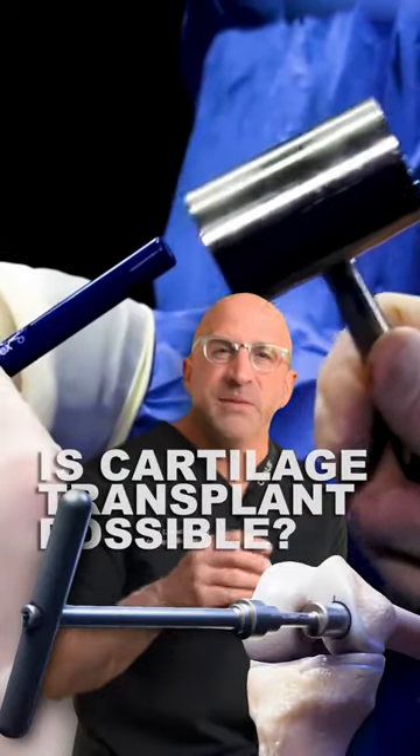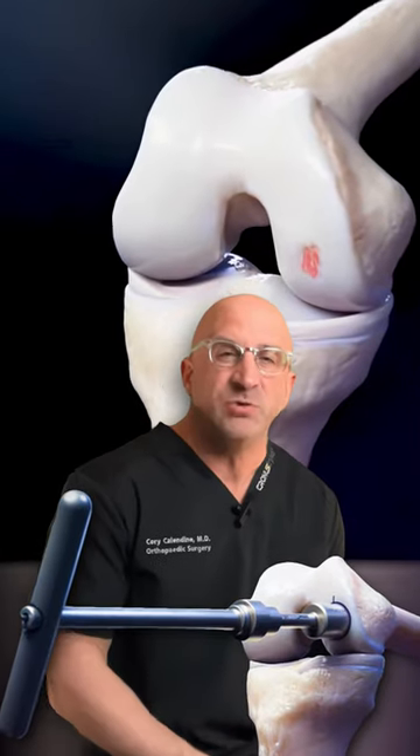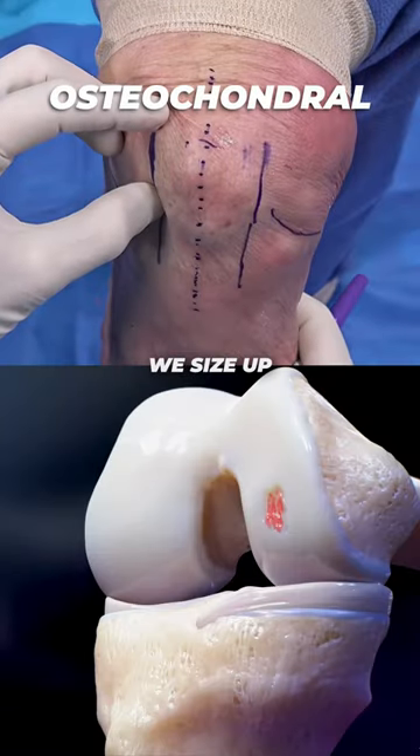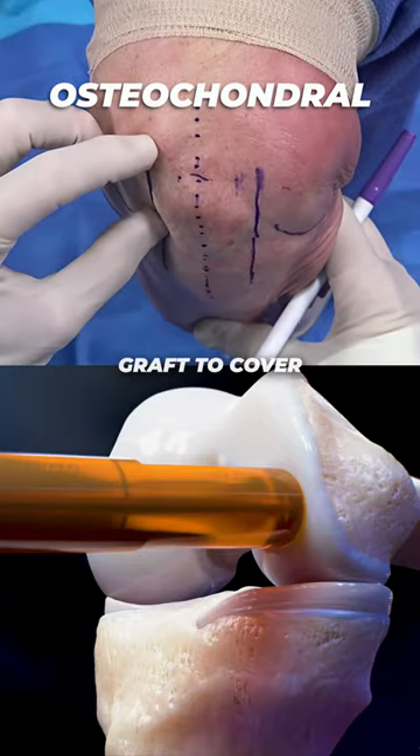Did you know sometimes we're able to take bone and cartilage from a healthy part of the knee and implant it into a damaged area? First, we size up the damaged cartilage in order to choose the right size graft to cover the lesion.